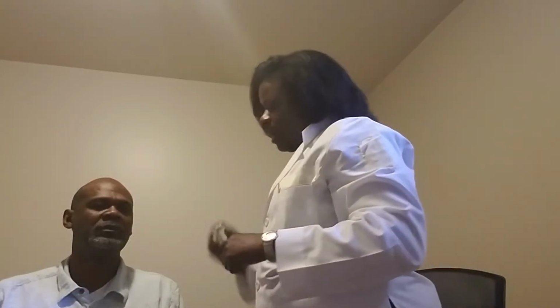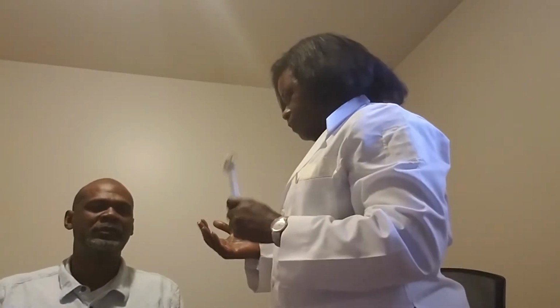Okay. The next thing I'm going to do is test my client's high frequency sound through his ears. So I'm going to tap on my tuning fork and place it at his mastoid bone behind his ear. Once he stops hearing the sound there, I'm going to bring it to the front of his ear. And I'm going to have him tell me when he stops hearing the sound there also. Ready, sir? Yes.